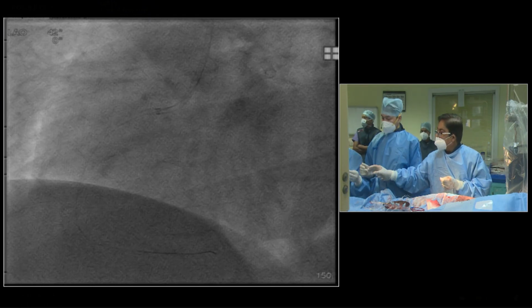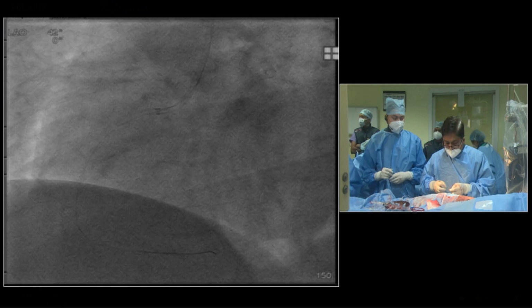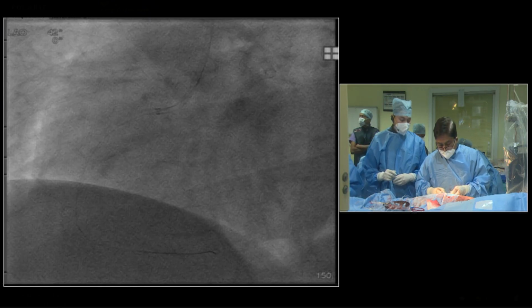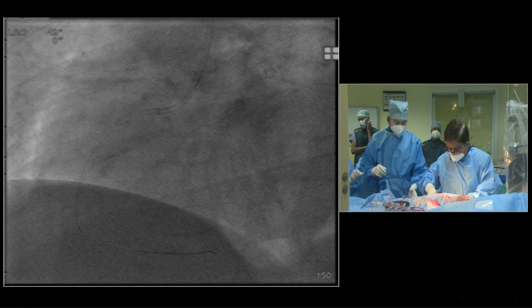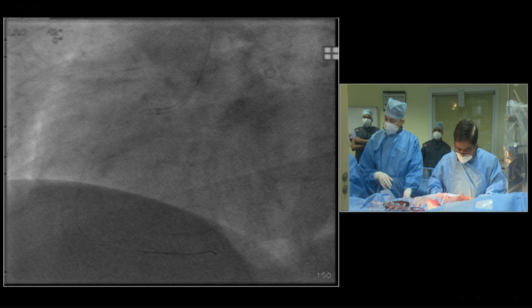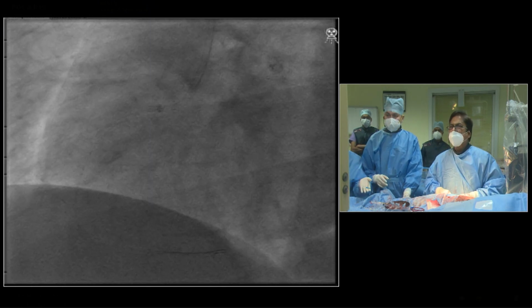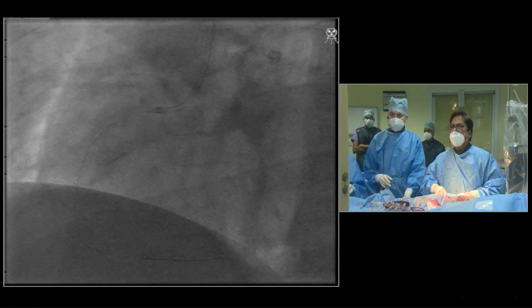No, Goel sir, we should demonstrate how the wire goes from the Crusade middle, that part. You please show that. After that, we will be off the live for some time if there is a discussion or some cases. That is the most important step. He wanted to demonstrate a Crusade to people. I don't think the camera guys could zoom there, but Goel can tell us what it is.